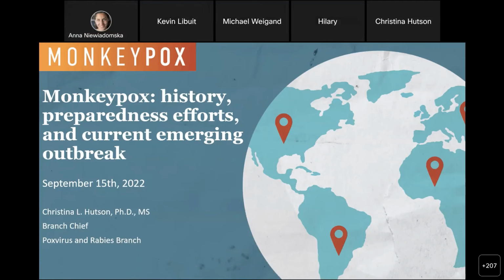Some other research efforts we are undertaking: we're really interested to see if there's a specimen that can be used for detection of monkeypox before rash onset. We know lesions are the best specimen to use when they are present, but is there something that we can test before lesions to determine if someone is infected with monkeypox? We have an ongoing study with our DC public health partners to look at blood, throat swabs, and rectal swabs from individuals that are at high risk of monkeypox. We just started receiving those specimens in our lab in the last couple of weeks.